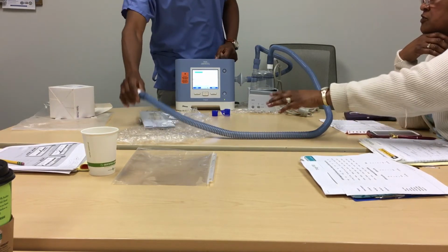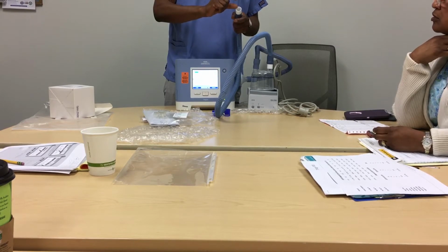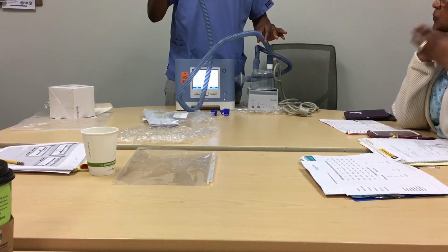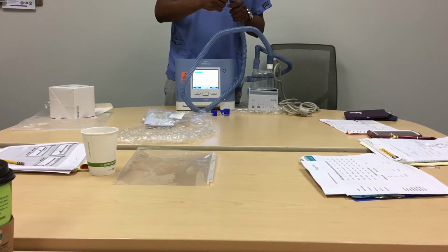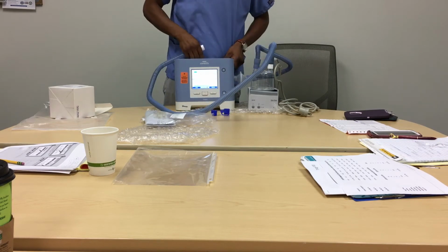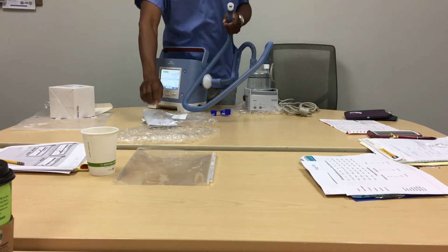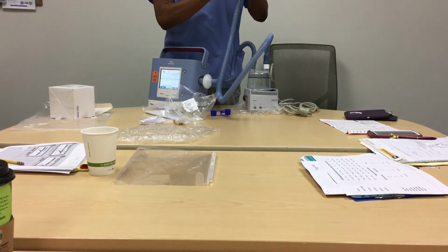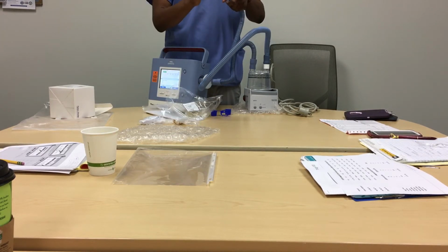Now, what about the trach? How are you hooking up? What's the piece for the trach? Typically we will have a 15 millimeter adapter, or the single connector if they are on a passive circuit, which will connect to the trach. If they are invasive, it's just a 15. No, the tubing connecting it to the exhalatory port, right? The 15 millimeter swivel. If they are invasive, the swivel is for a passive circuit. You connect the 15 to the T adapter if they are running invasive, then the trach.